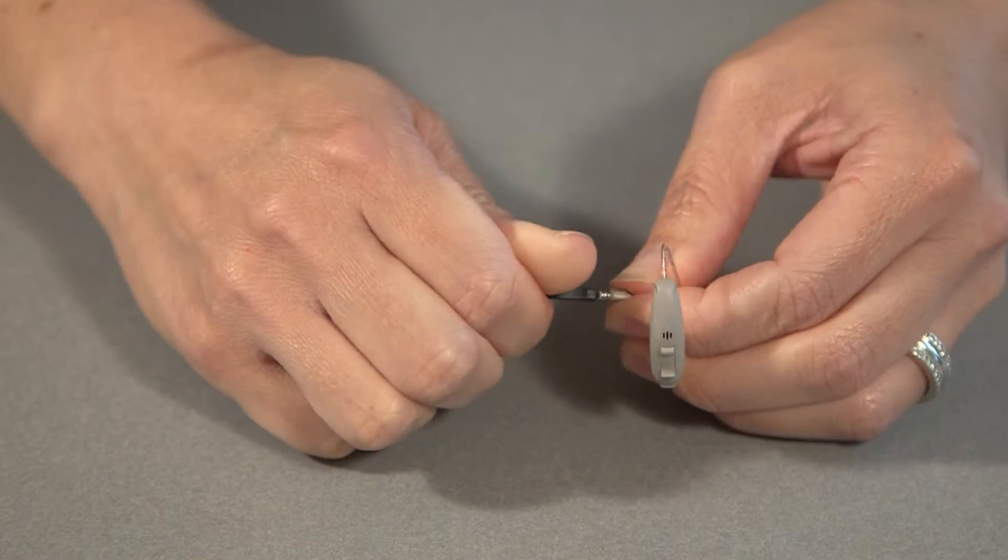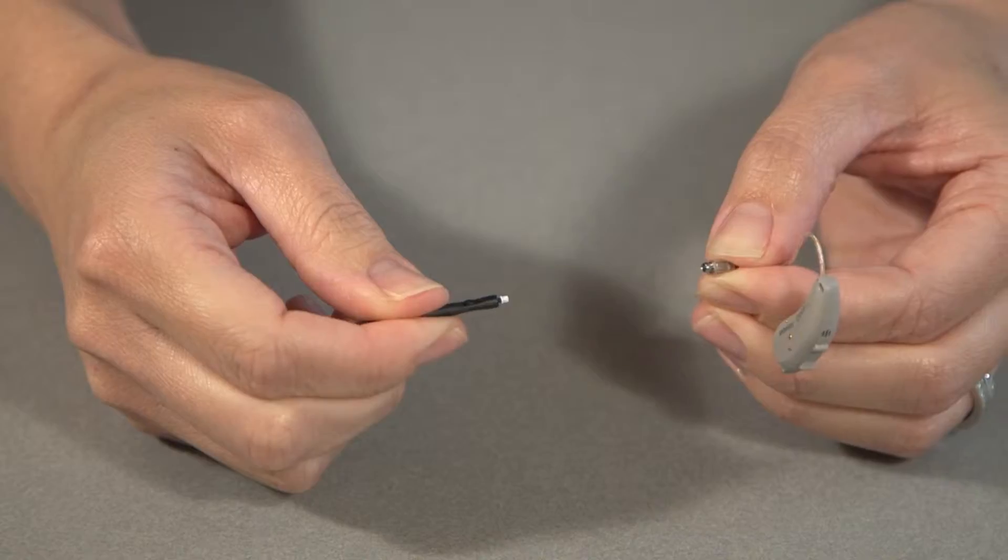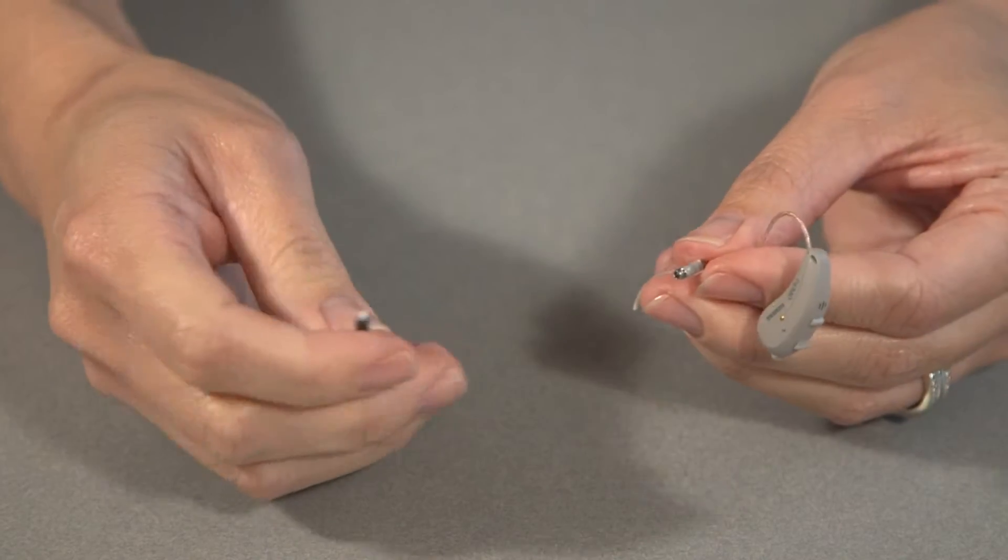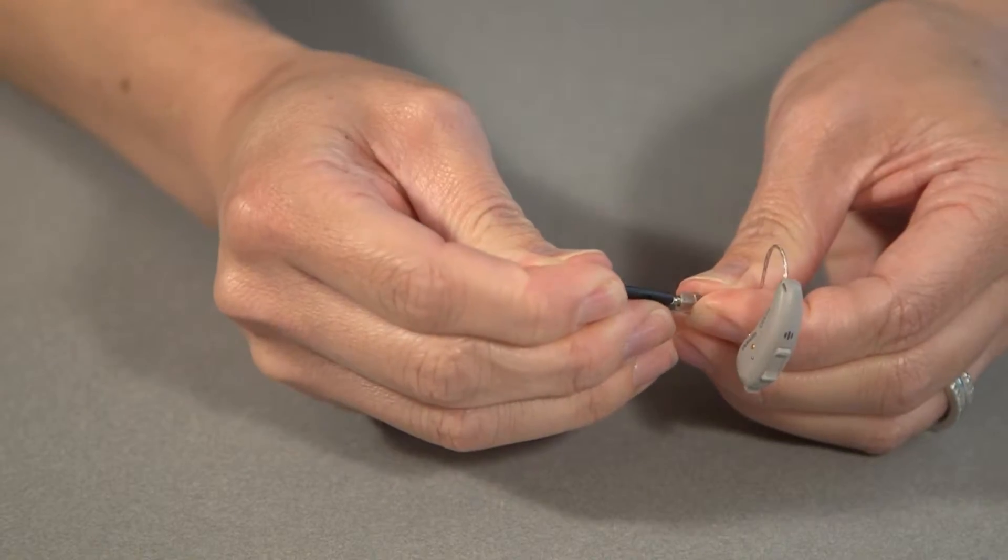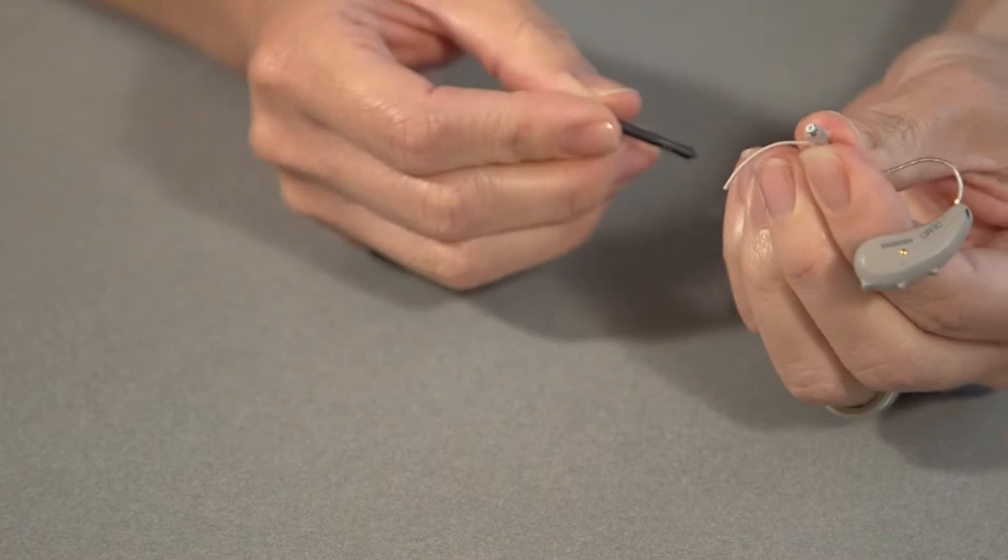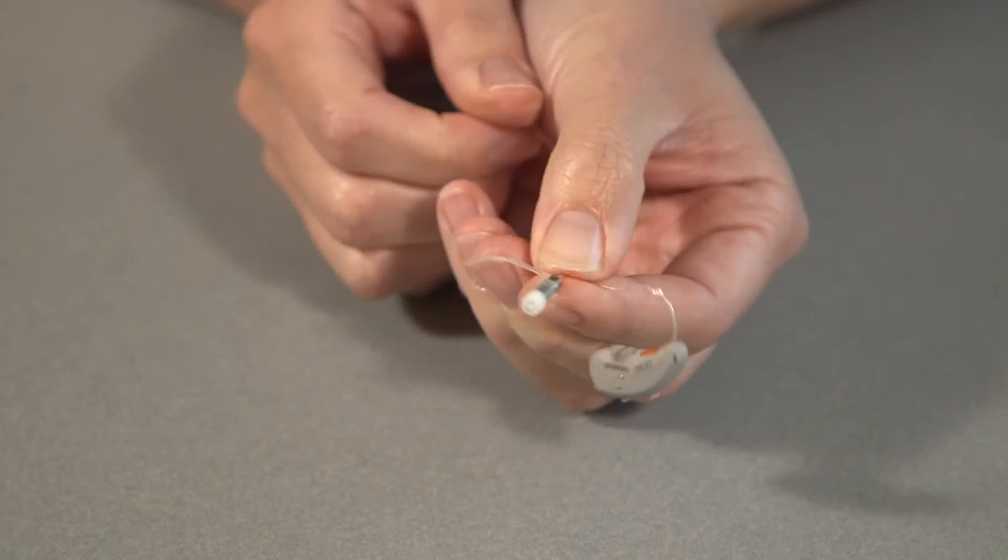To replace that, just twist it in and pull it out, turn the stick around and insert a new one and then this just gets tossed in the garbage. Then put the new dome, you snap it on the end just like that.